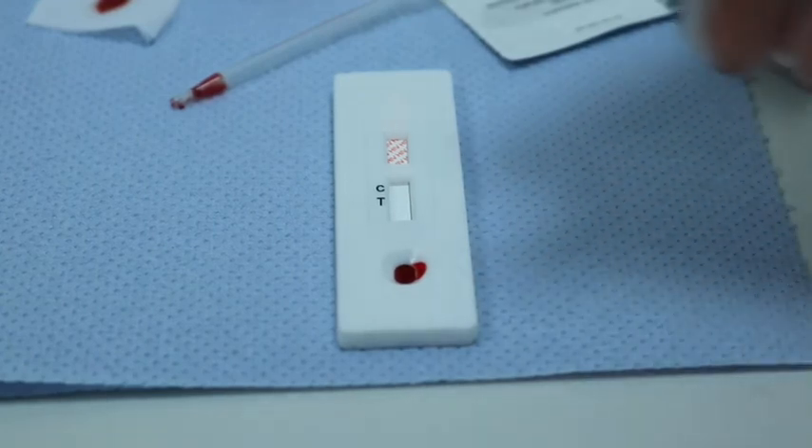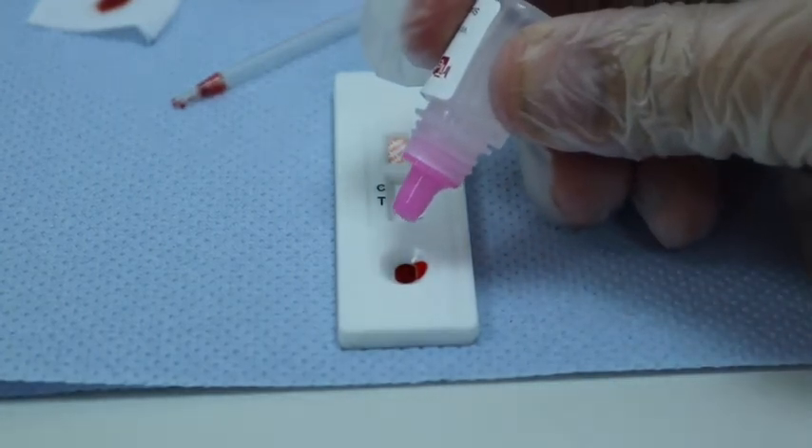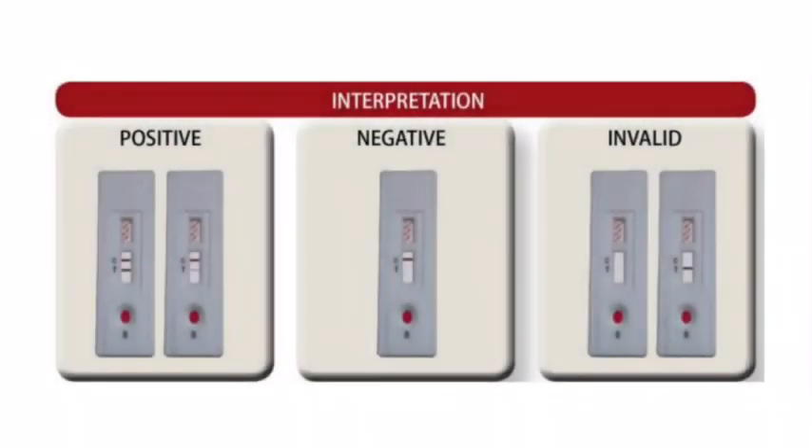Gently shake the buffer bottle in an upside down position and dispense one drop of buffer into the sample S-well. Please note that this test should only be carried out by a trained healthcare professional. Further, while the test is highly accurate, results must be confirmed at an accredited laboratory before any clinical action is taken by a qualified physician.